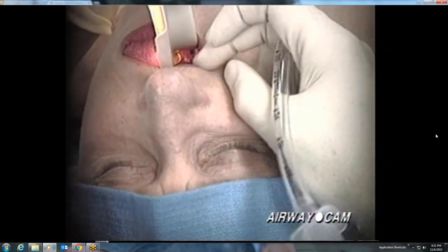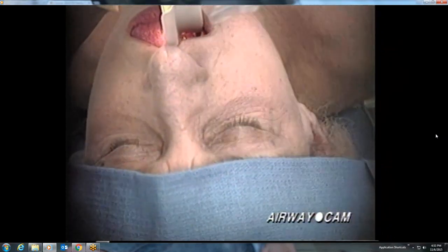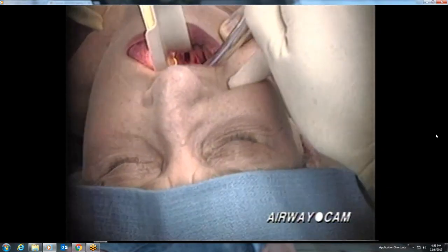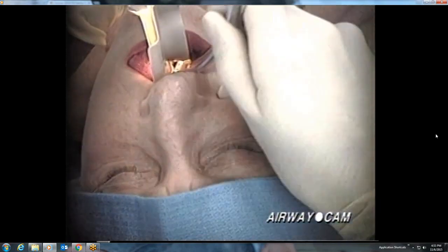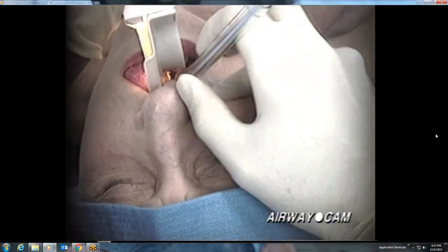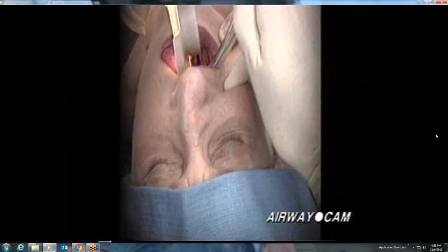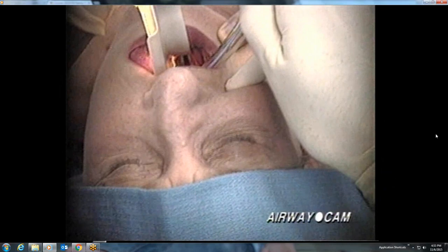The tip of the curved blade has been inserted beneath the epiglottis instead of into the vallecula. The laryngoscopist retracts the upper lip and carefully directs the tube down the right side. The tube is advanced until the cuff of the endotracheal tube has been placed beyond the vocal cords. Reviewing the laryngoscopic view on this patient, notice how effectively the tongue has been controlled on the left side of the mouth. The lack of upper teeth opens up the mouth and makes alignment of the larynx with the line of sight less difficult. The white of the vocal cords is well seen.